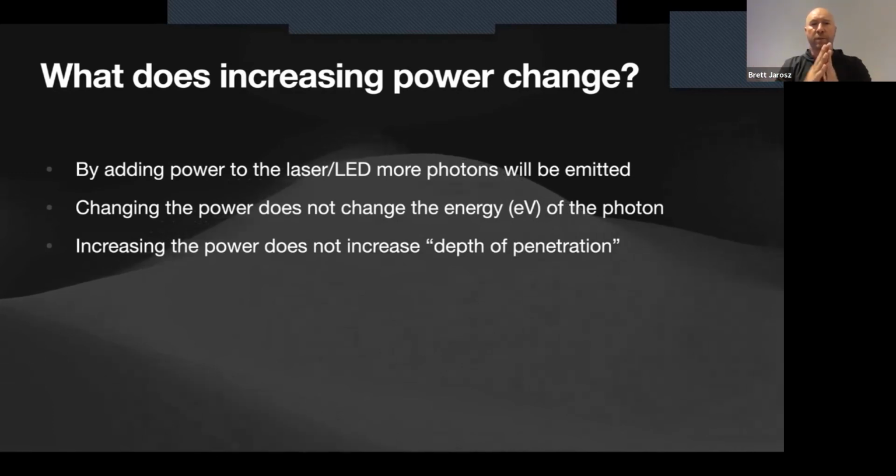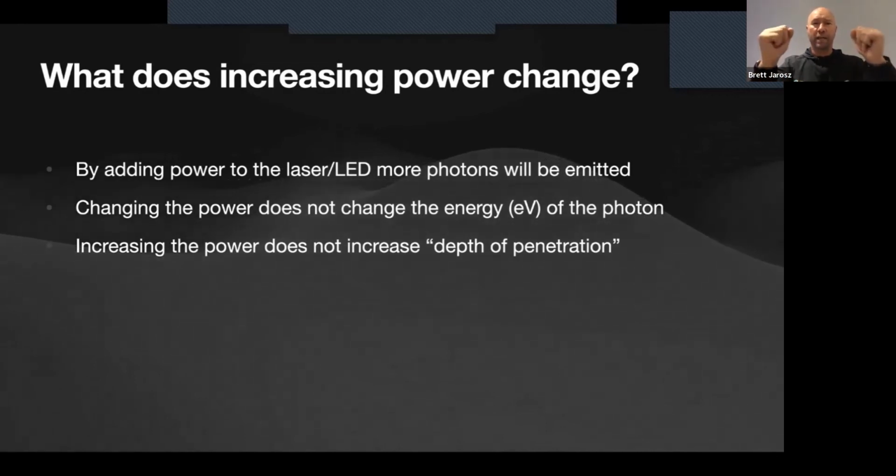All right, and as we talked about, the absorption and the penetration, I'll use another slide coming up in a sec, that's all got to do with the wavelength. That wavelength is what's generating the penetration through our tissues. So increasing the power does not increase the depth of penetration. It's just getting more buckets of the same thing and throwing more of it at the person.